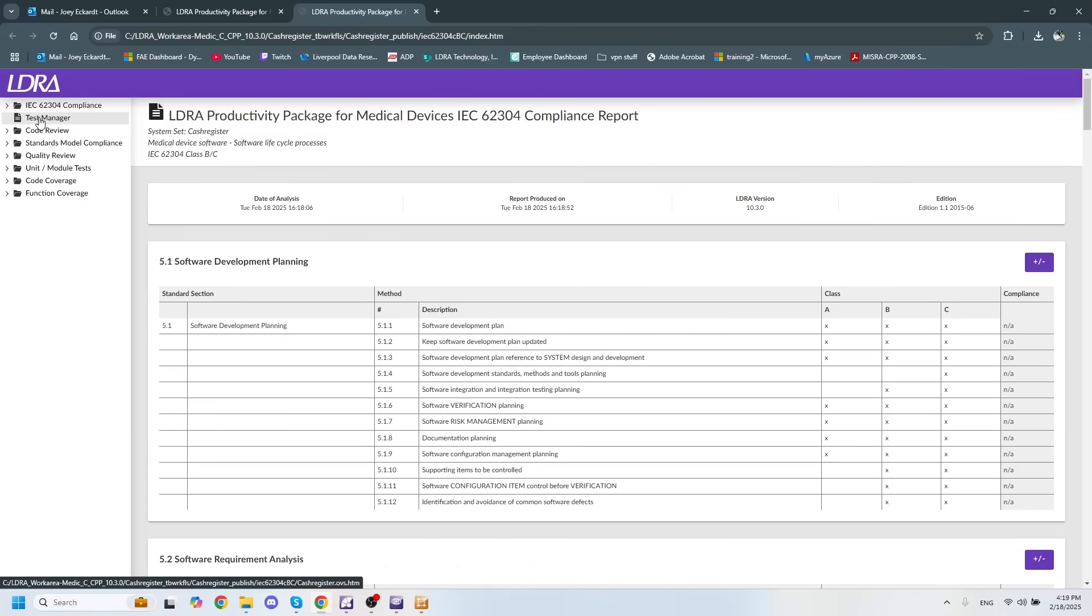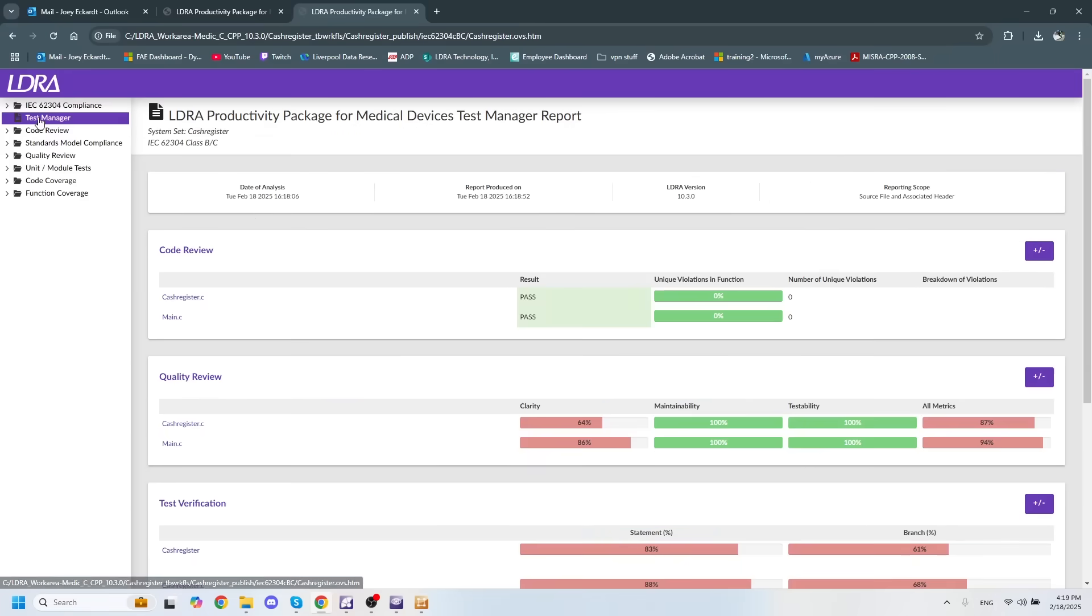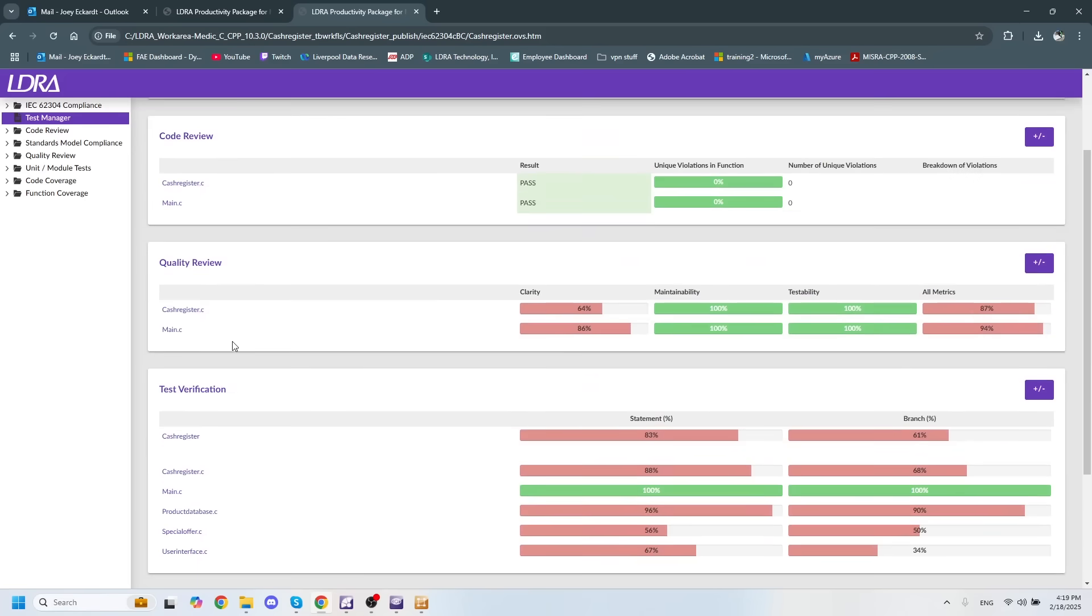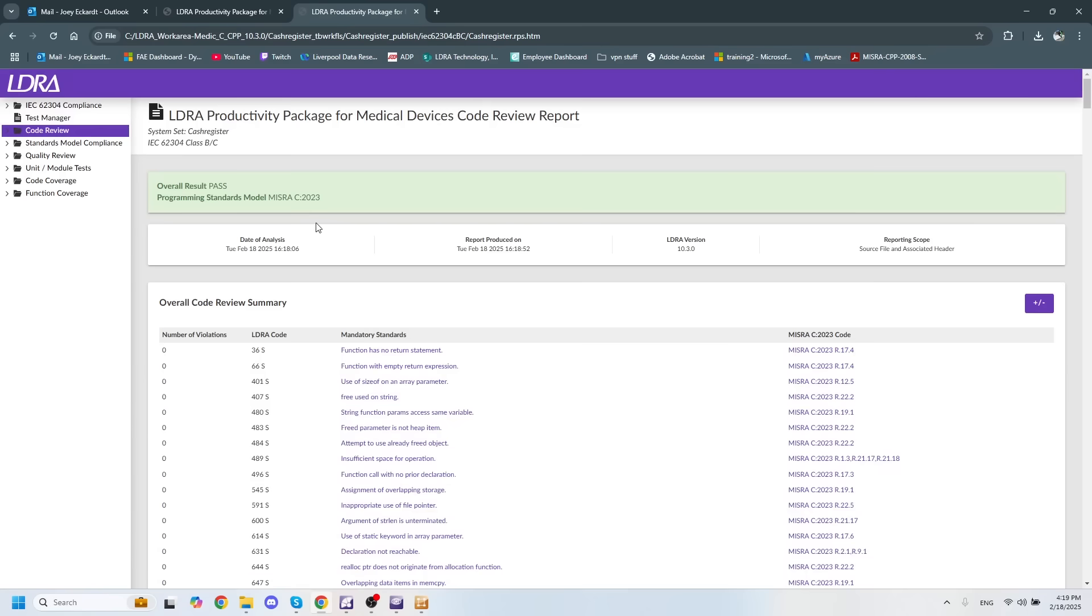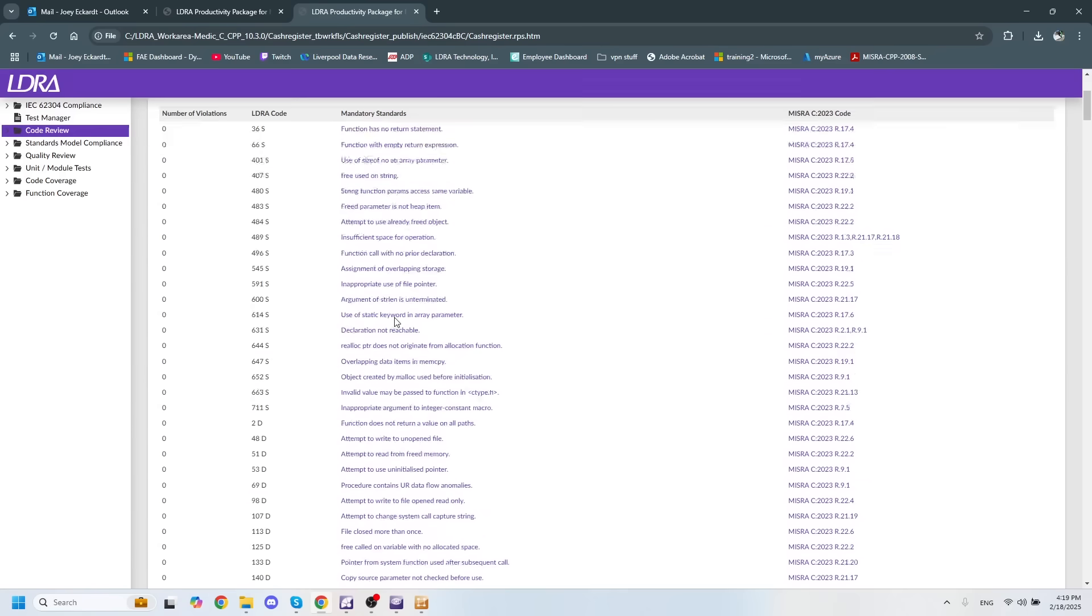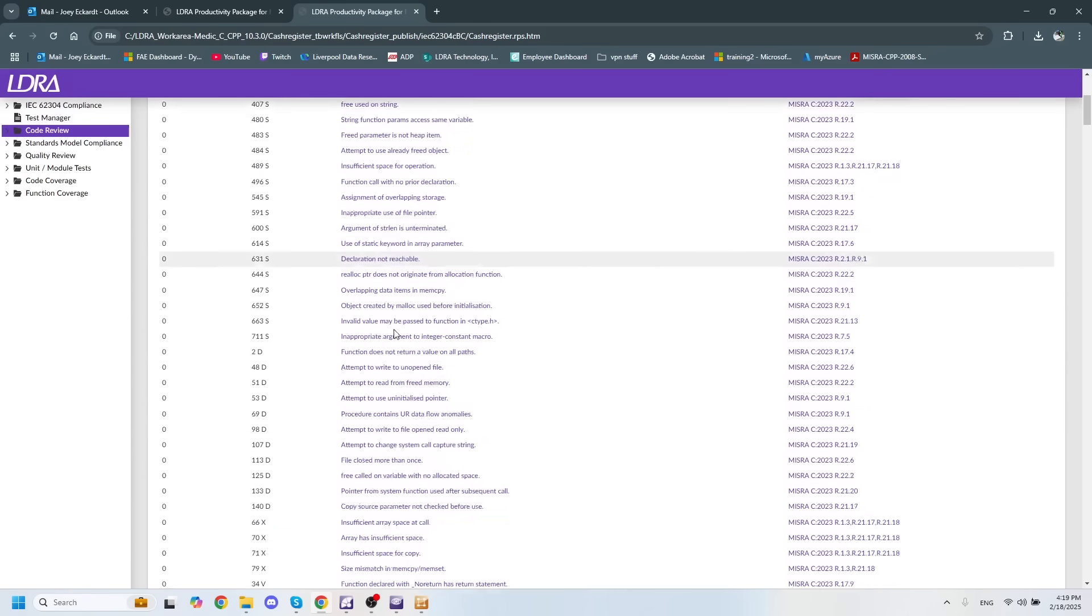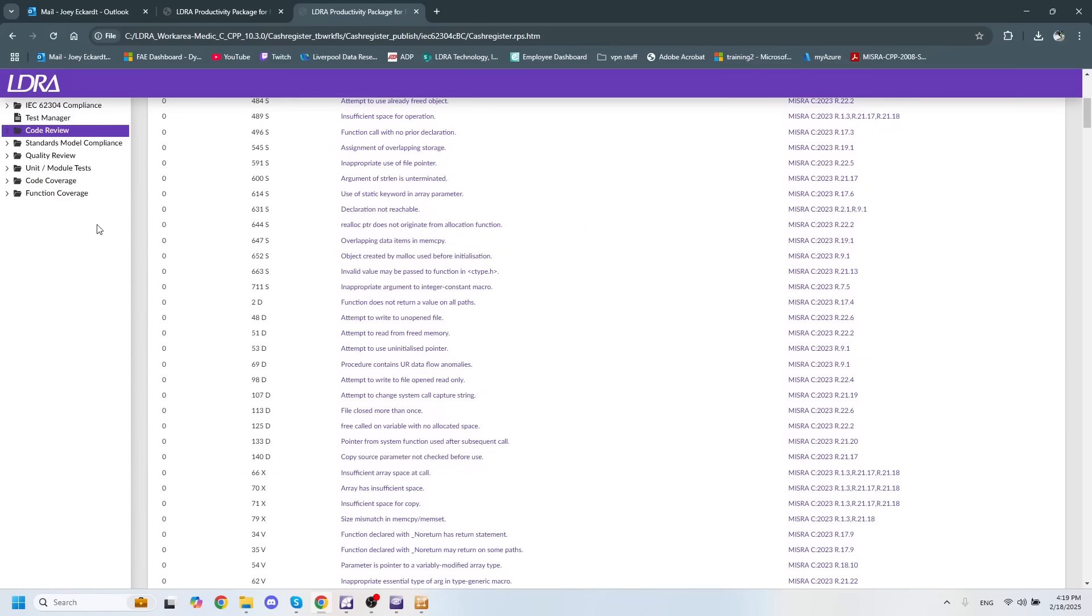We also have a test manager report to show off code review, quality review, as well as our statement and branch decision coverages. We have a code review report, which is very similar to the one that we had generated earlier.